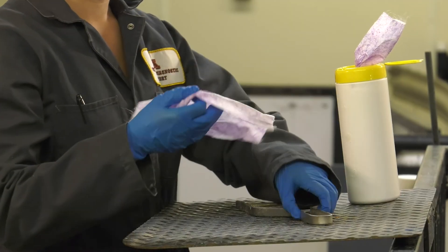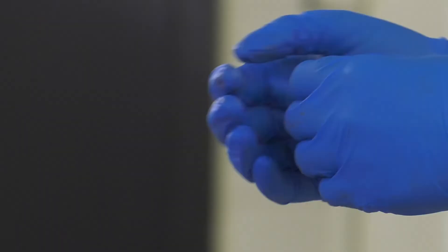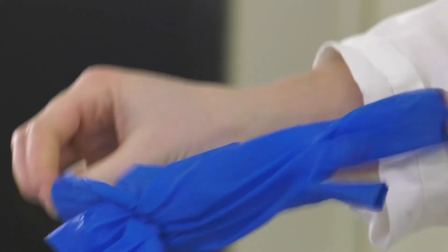Use disinfecting wipes to clean all tools that will be used on the next group of pigs. Anything that could possibly contaminate the sampling from one pig to the next must be replaced or cleaned.